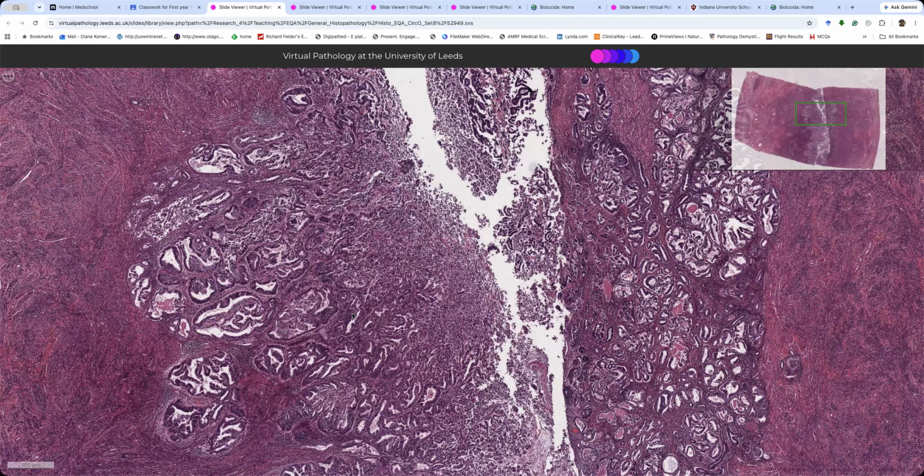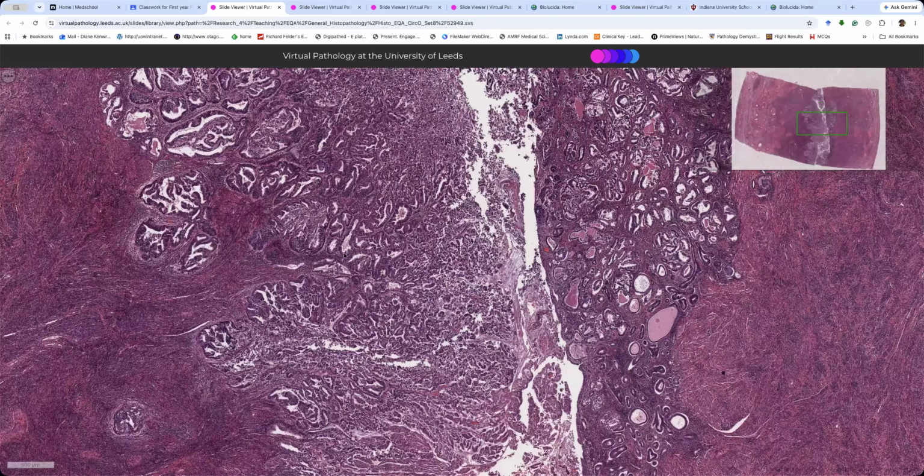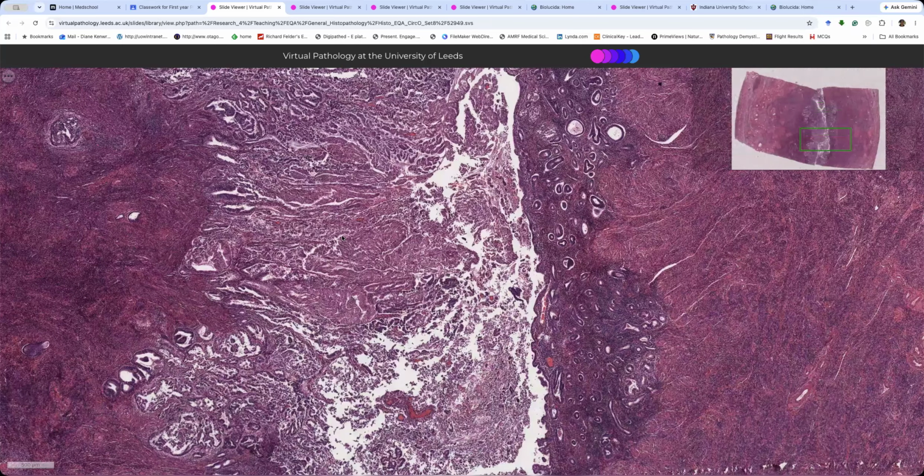Come on, I want some more participation. I don't really care what you write. I just want you to write something. Yeah, almost all glands. So it's a 1. It's a 1. Okay, because this is just porridge. All right, but is all this cancer, or is it? Is it cancer or is it exogenous or is it atypical hyperplasia? So now we have another question. How do we tell atypical hyperplasia from cancer, particularly in this autolyzed mess? It is grade 1, by the way, because you don't count the autolysis.